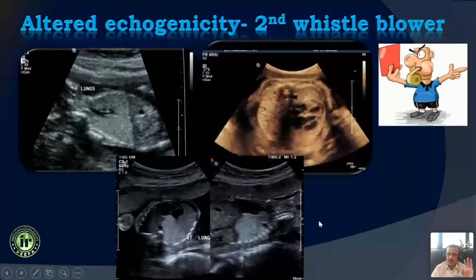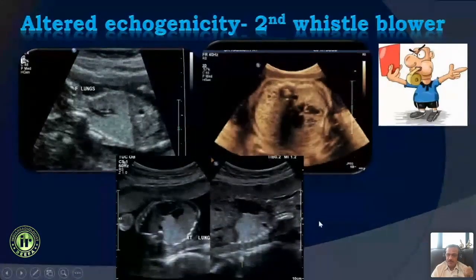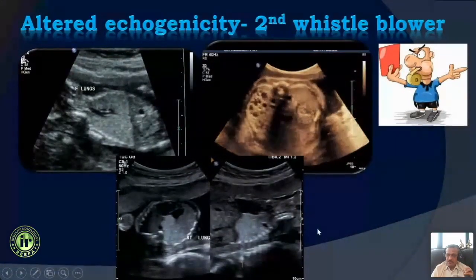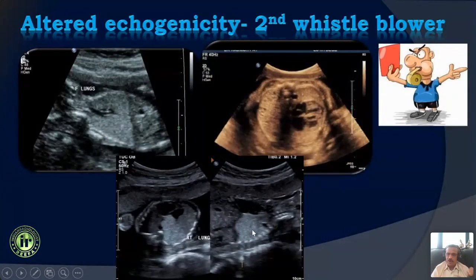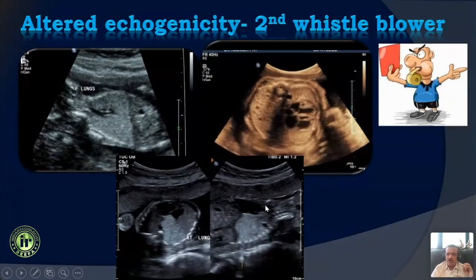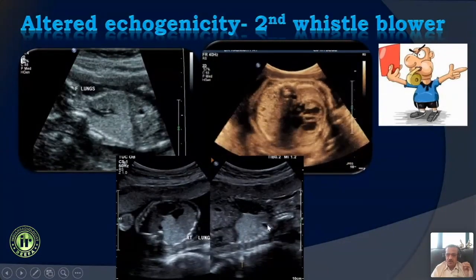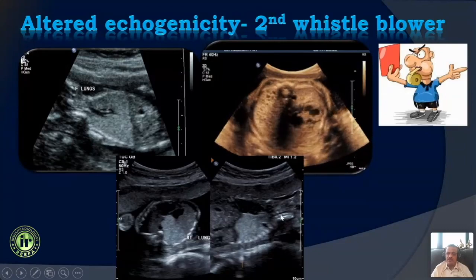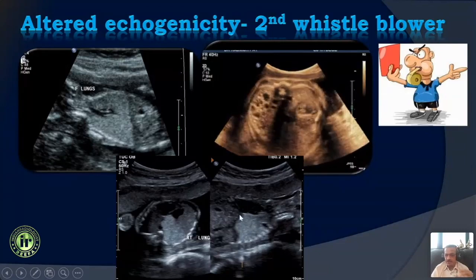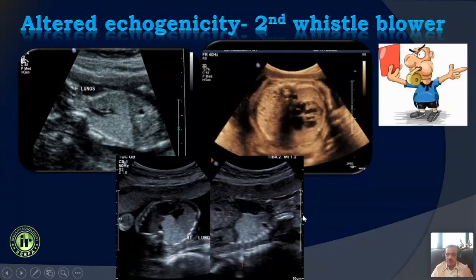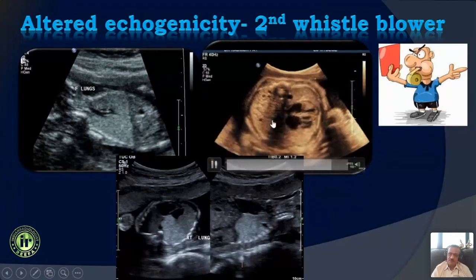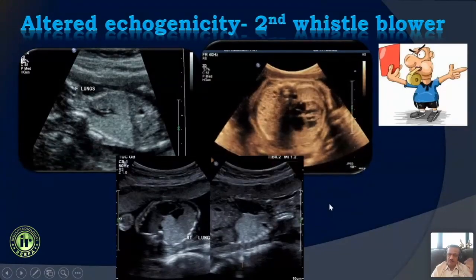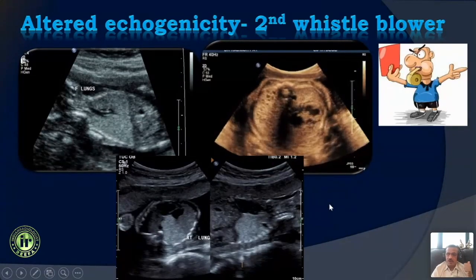The second whistleblower is the appearance of the lung. Typically, lungs are slightly more hyperreflective compared to the liver. But if the echogenicity is significantly different compared to the liver, that is another clue that something is going wrong in the lungs or thorax. This can include a large hyperreflective mass, as we will see later on.